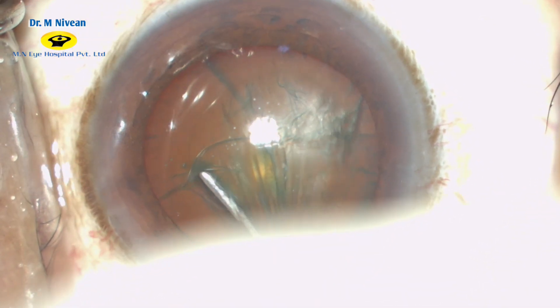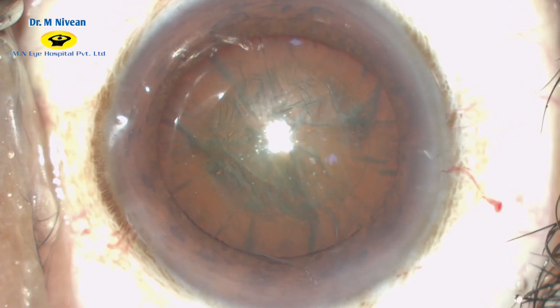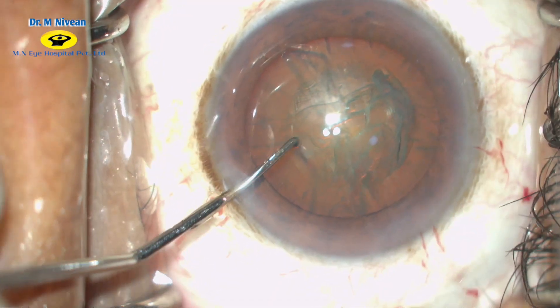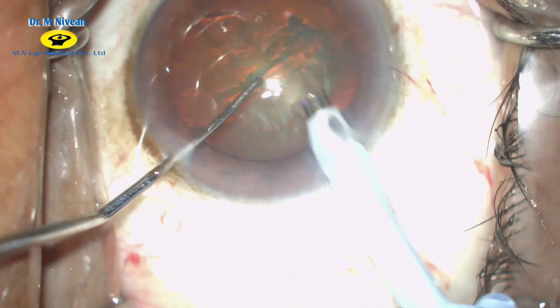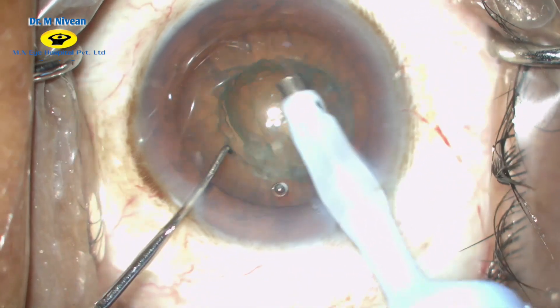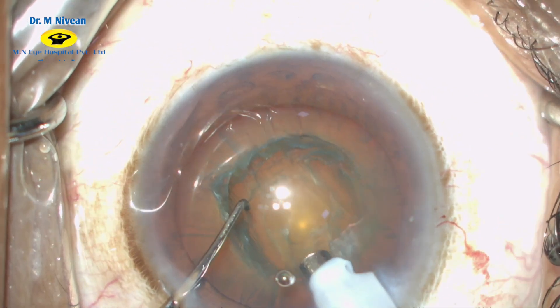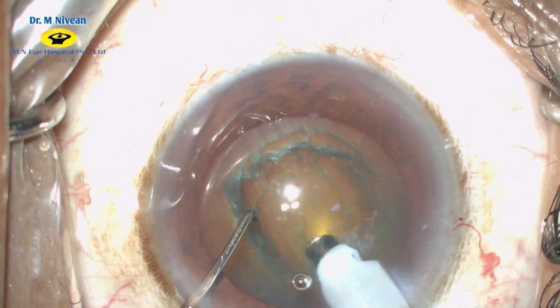The nucleus is then tapped in the center and the same procedure is repeated on the opposite side. In phaco mode with a power setting of 40 and a vacuum of 50, the cortical matter is removed first so as to get a better hold onto the nucleus while doing the chop.